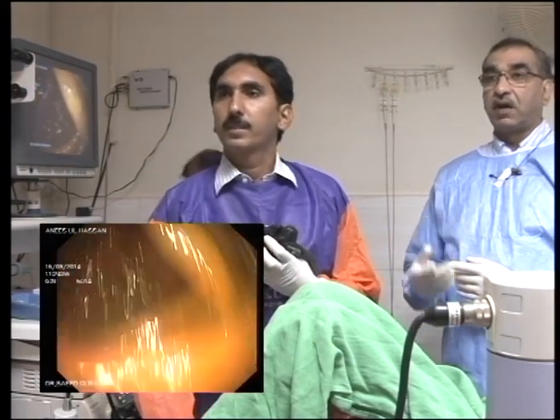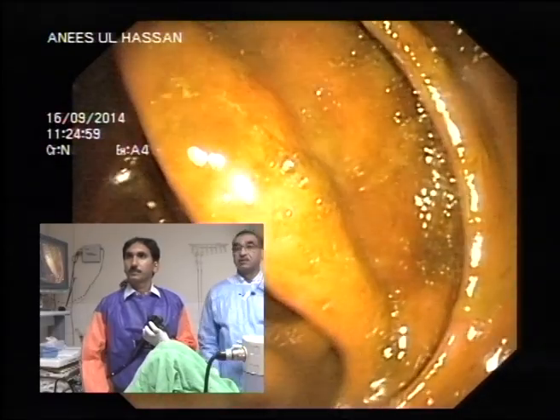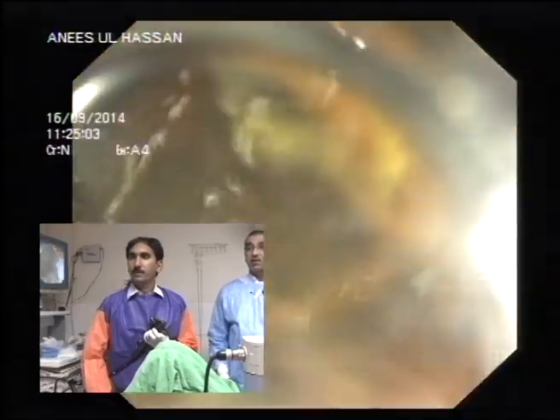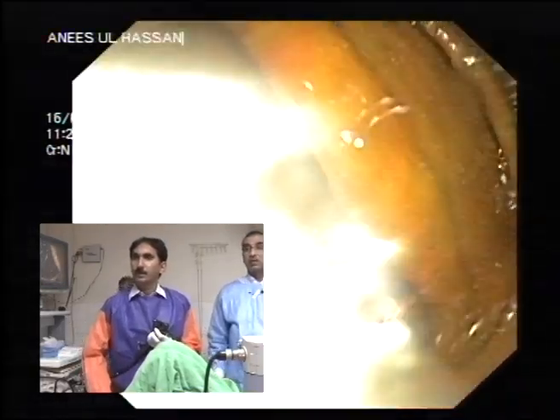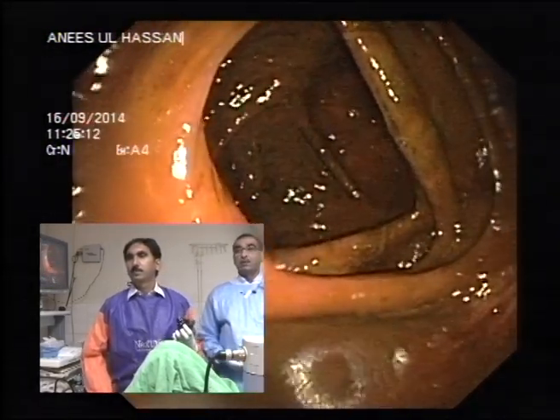ठीक है, आप आहिस्ता आहिस्ता आना शुरू कर दें, and don't inflate any extra air. Clear your lens. अब आहिस्ता शुरू करें, start coming out. Okay. Right.